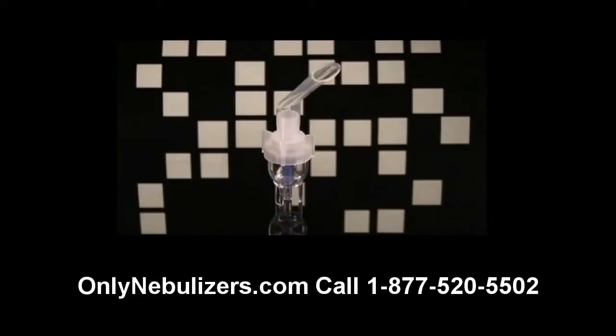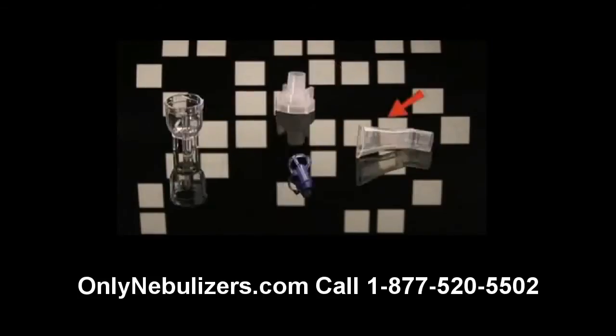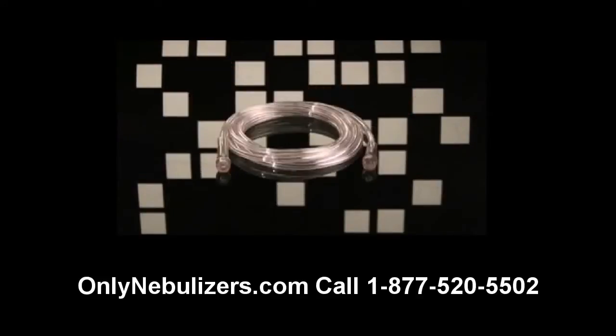Please note that in the future you may receive a nebulizer from your provider that looks different from this one. However, the care and use of most disposable nebulizers is similar. Your nebulizer consists of a mouthpiece, medication cup, nebulizer cap, baffle, and tubing.